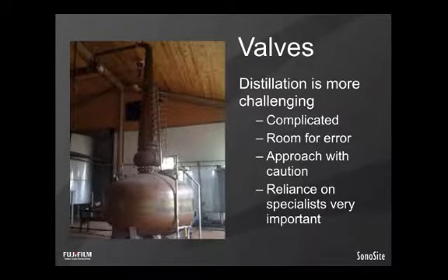So when it comes to assessing valves, a distillation of this topic into a compact and manageable size and intellectual scope for point of care is more challenging than some of the other topics that we have covered, including the pericardium, the left ventricle, the right ventricle, hemodynamics.